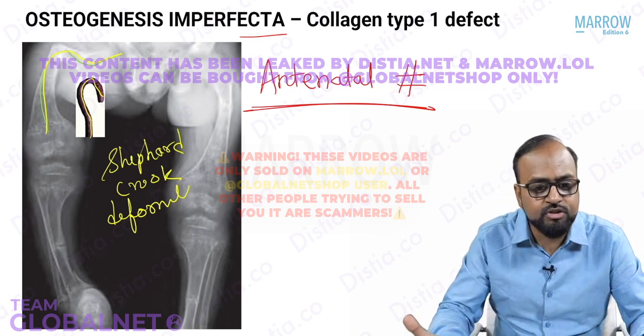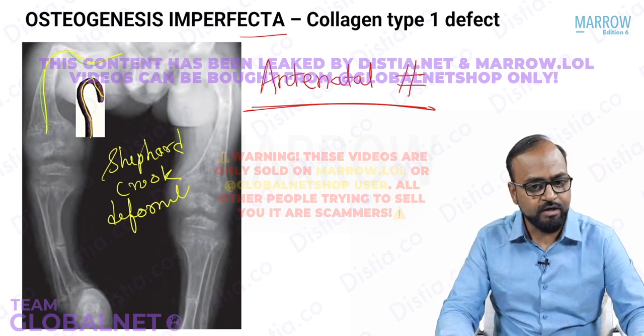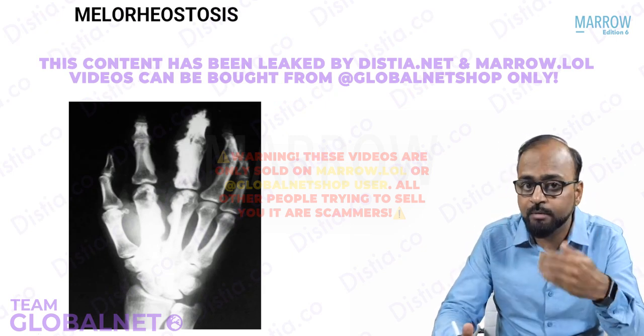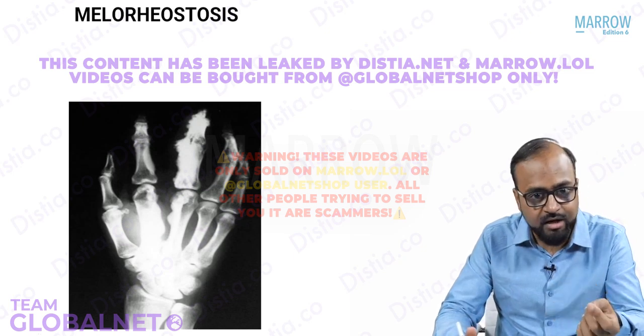There are Wormian bones which are also seen. Bones are grossly deformed, remember, in osteogenesis imperfecta. Now sometimes there is a flowing hyperostosis. A flowing hyperostosis along the vertebral margins anteriorly is called DISH, diffuse idiopathic skeletal hyperostosis.